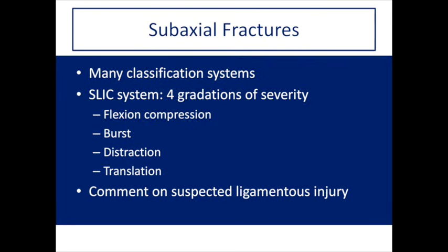The specifics are beyond this lecture, and again, I suggest reading the radiographics article for a good summary of the SLIC system. Now, if this is the first time that you've ever learned about C-spine fractures, this might all be gibberish to you. But once you've been more exposed to these types of fractures, this is going to make a lot more sense. If this is too much for now, just know that there are many classification systems out there for subaxial C-spine fractures, and the SLIC system summarized in the radiographics article makes it easy to understand and describe these fractures less variably.